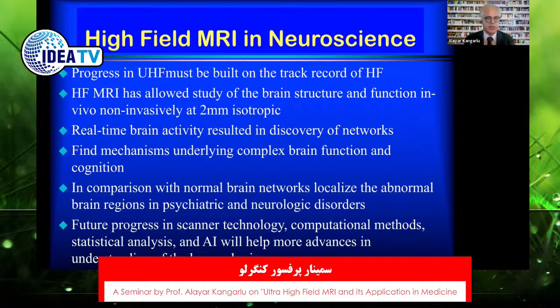In other words, we look at the major sources of motion, such as respiratory and cardiac, and we can provide gating so that the images are acquired exactly at the same segment of the respiratory and the cardiac cycle. This way, you take a snapshot of the body, whether it's the abdomen or the brain, at the same spot as you took its image the time before, and you can eliminate the role of motion and physiological effects in MRI.